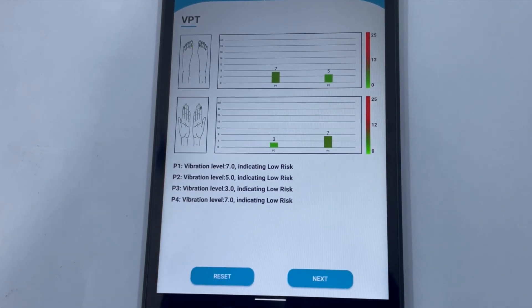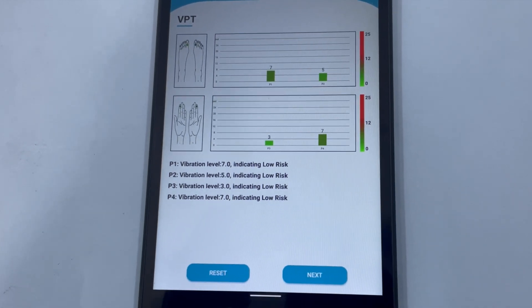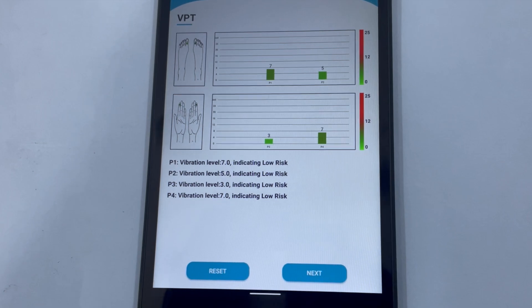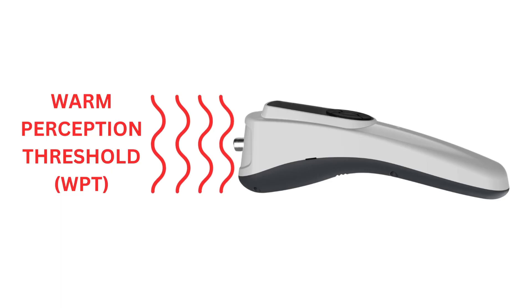This will generate a VPT summary report on the device screen and also send the VPT data to the app. The VPT report, including a graph, will be generated in the app.